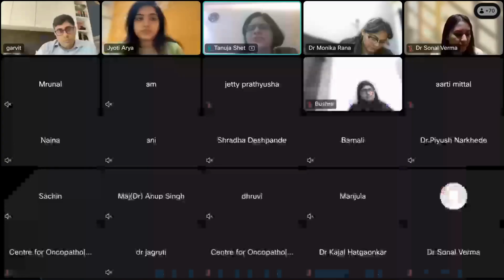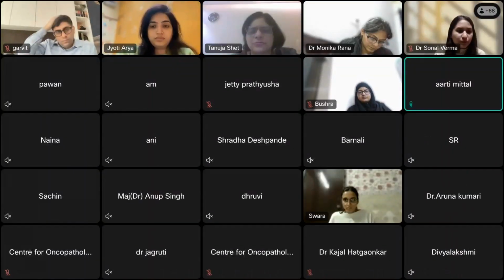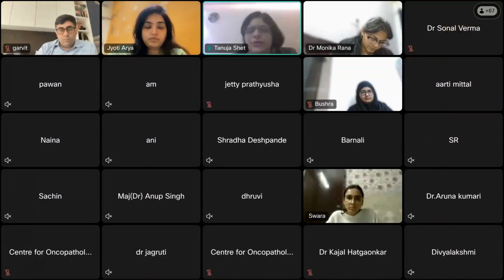Anybody want to ask any questions at this end? Ma'am, someone is asking for the last IHC slide for angiosarcoma, to show it again. Yes, ma'am, to show it again.